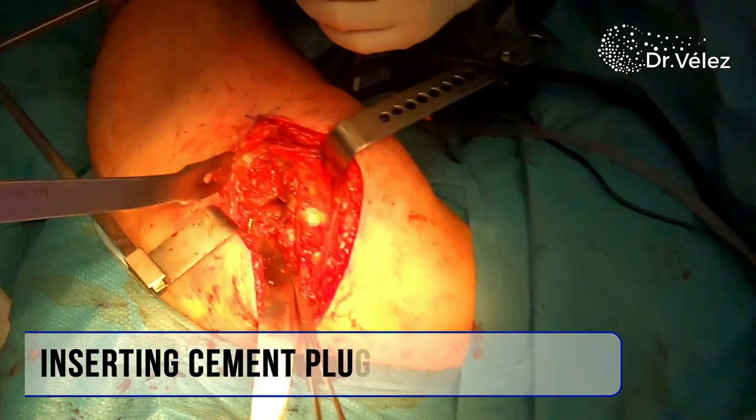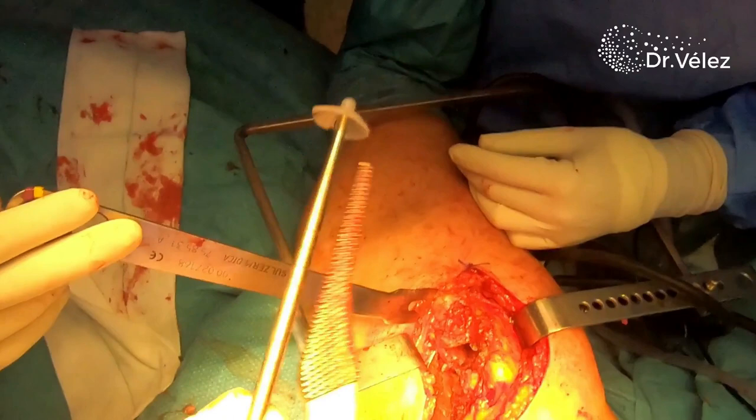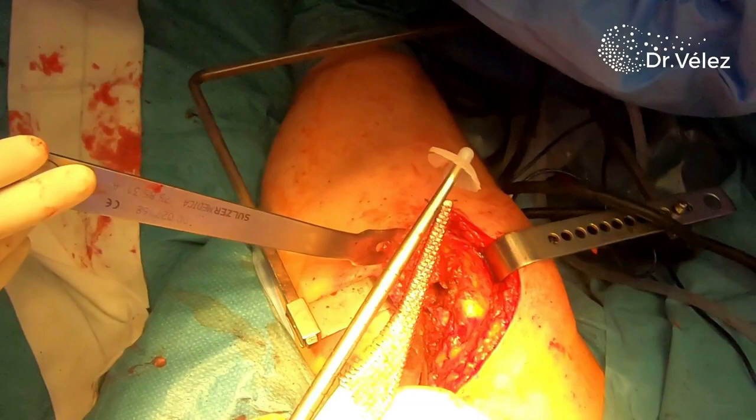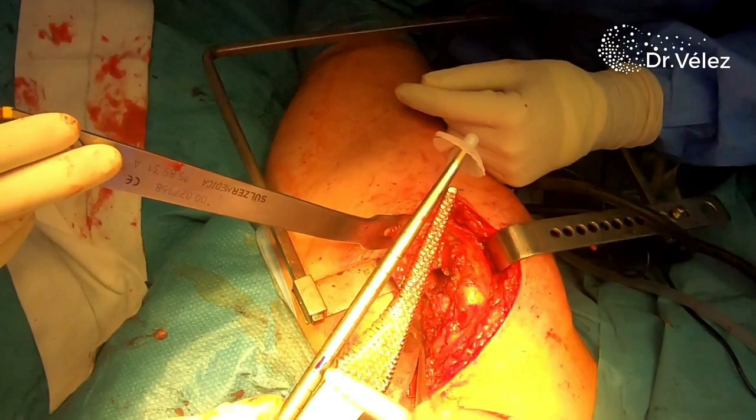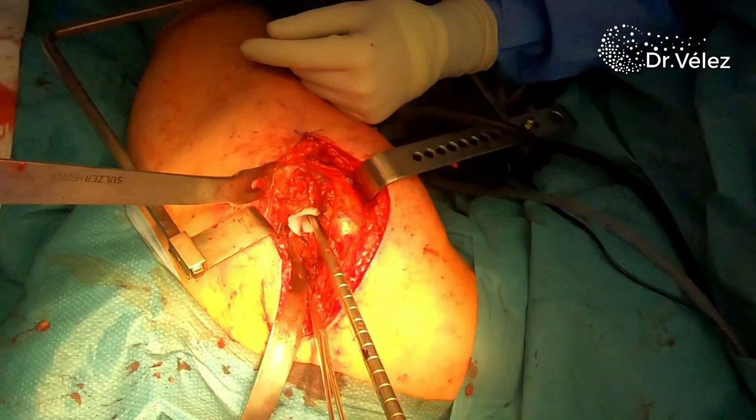We've now placed the hip again in internal rotation. We place a two-pointed Hohmann retractor in the greater trochanter and a Charnley elevator in the anterior aspect of the femoral neck, exposing the femoral canal. Then after choosing the correct cement plug and marking the depth that we're going to introduce the plug, we carefully impact it within the femoral canal.